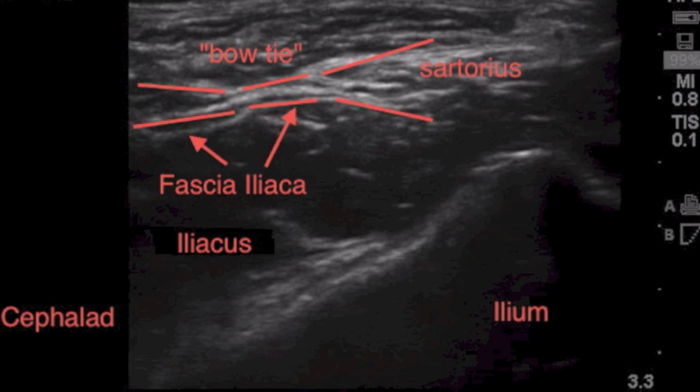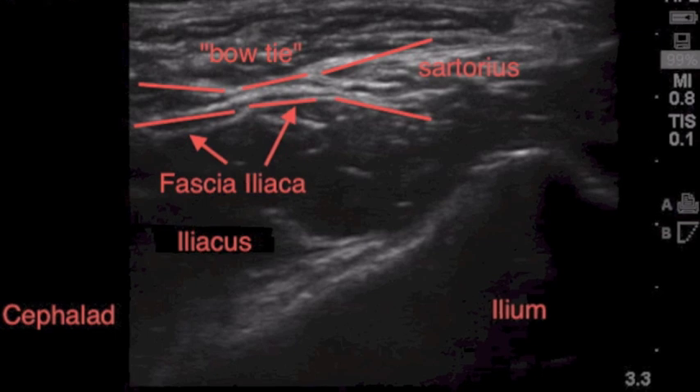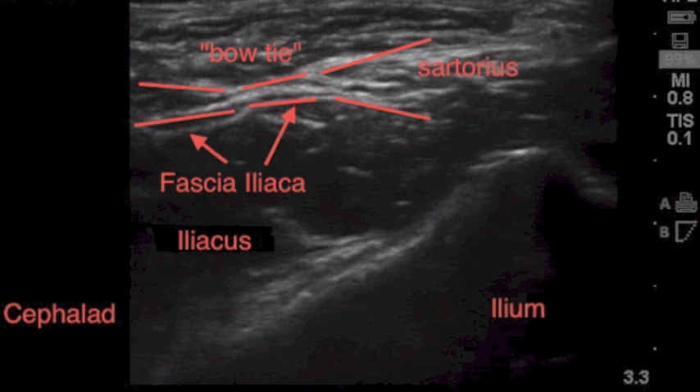When we show you the ultrasound of the block, your goal will be to inject underneath the fascia iliaca and have the dissection head toward the cephalad direction to bathe the whole bowl created by the iliacus muscle with local anesthetic. This will ensure that you get your lateral femoral cutaneous, femoral, and obturator nerves through this block.